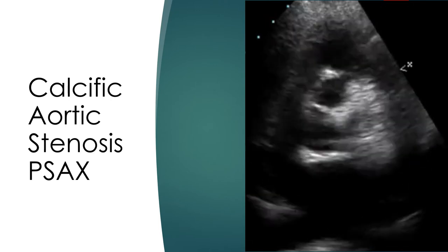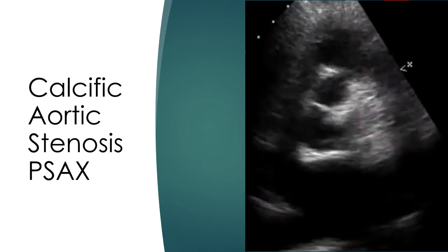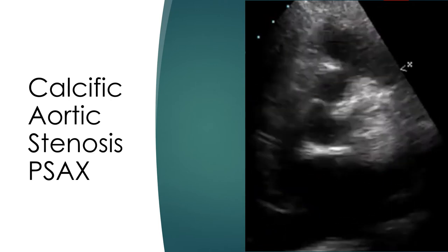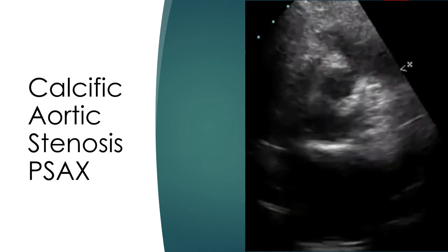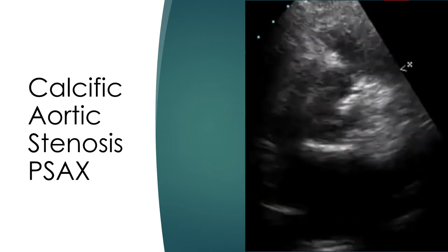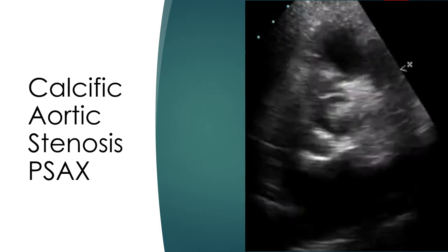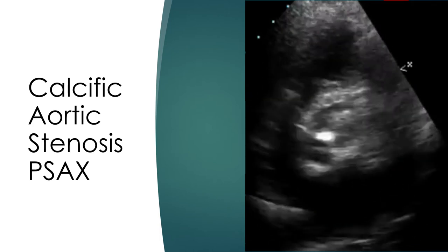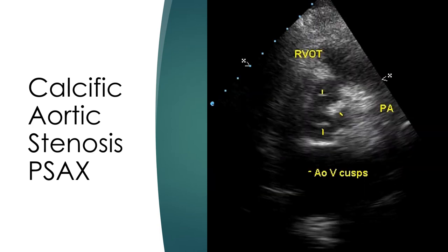Calcific aortic stenosis in parasternal short axis view showing three leaflets. Dense calcification is visible. Still image in parasternal short axis view in calcific aortic stenosis showing three leaflets in open position, i.e. systolic frame.